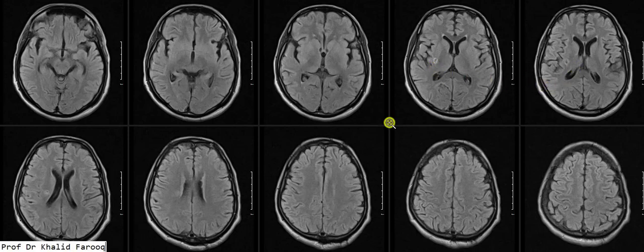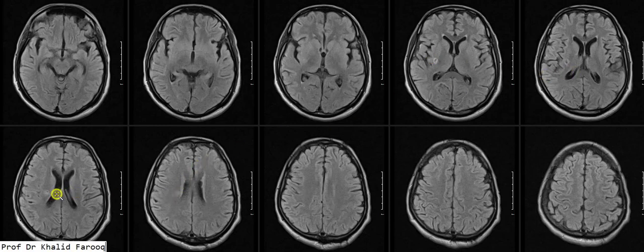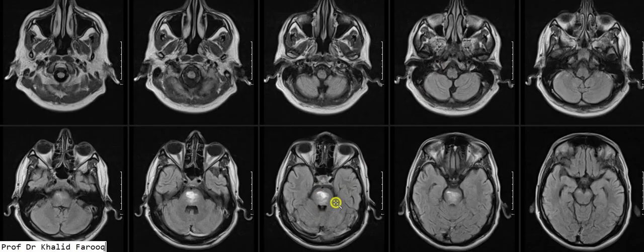The ischemic changes extend into the right periventricular region, while the remaining brain is unremarkable. So this is a case where we have seen old ischemic changes in the right periventricular region including the posterior portion of the right basal ganglia, and pontine hemorrhage. Thank you very much. Assalamu alaikum wa rahmatullah.